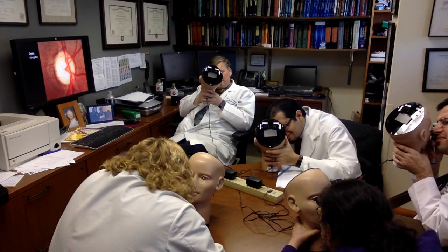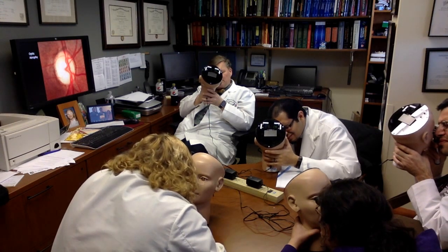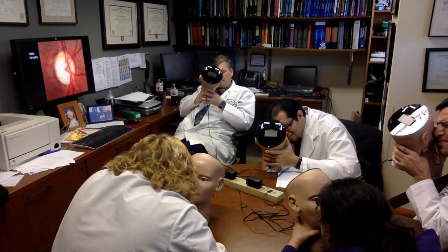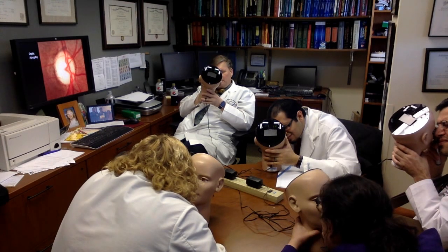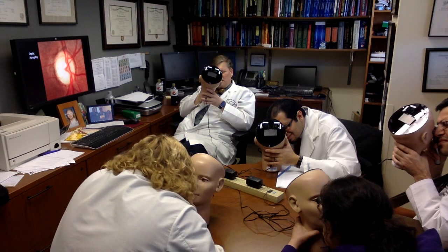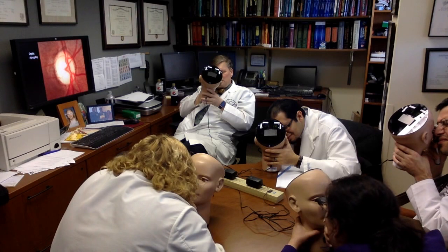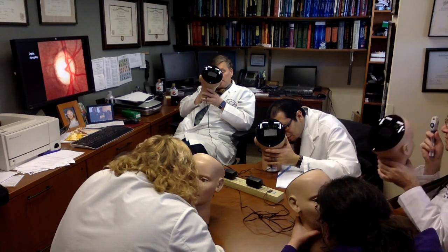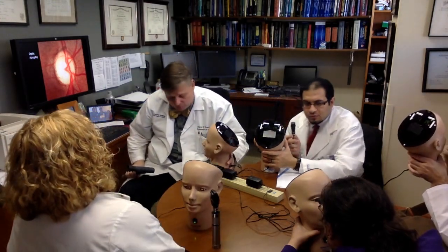Now, once you have the disc, follow the blood vessels down at approximately 6, 7 o'clock. Down. You see this big vein, it'll bifurcate. And then you'll see this important finding roughly about 7:30. Nicking? That's nicking, exactly. The artery is running over the vein, and you see this nicking. And when do you typically see this? Hypertension, exactly. So the optic atrophy is probably from chronic hypertension.